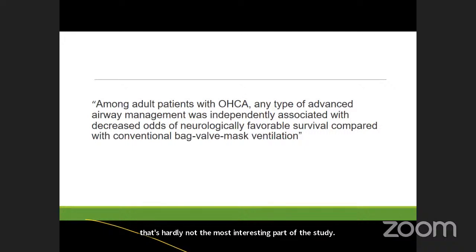Among adult patients with out-of-hospital cardiac arrest, any type of advanced airway management was independently associated with decreased odds of neurologically favorable survival compared with conventional bag valve mask ventilation.